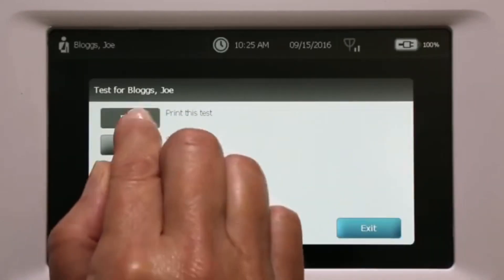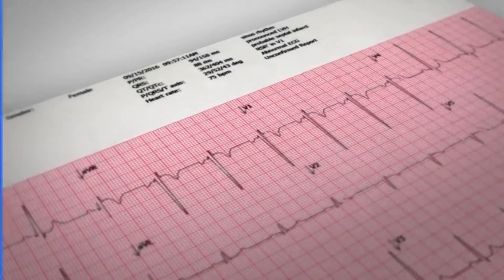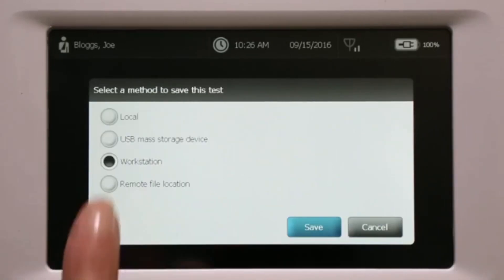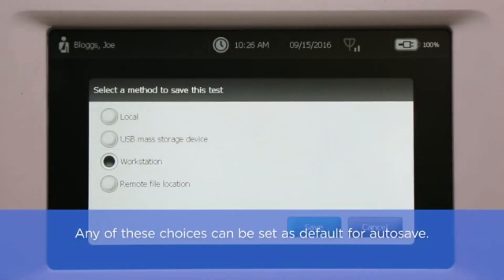Press Print. With optional means interpretation, a summary will also be printed at the top. Now you will be prompted to save the test. The CP150 offers multiple options for saving; however, in a connected environment, the most relevant choices will be Workstation, which proxies for DICOM image server, or a remote folder.